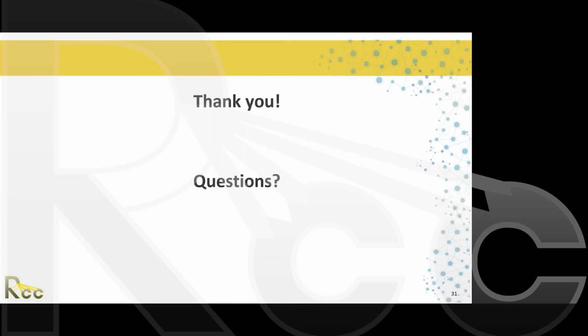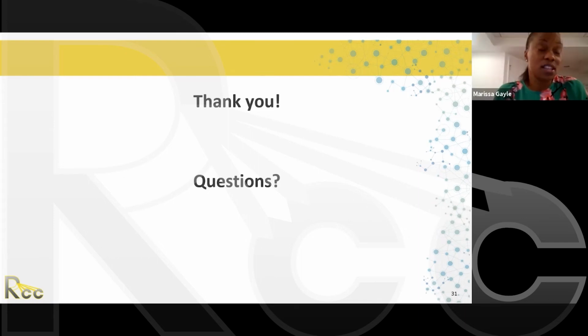Someone in the chat called it a ball bearing. That makes sense. It's a mark. It's a little circular mark that you're placing where you're marking your isocenter, so that when you do the CAT scan, physics, dosimetry and the planning team can see exactly where the isocenter is. So ball bearing doesn't sound too far off, but I can definitely find out that information when I go into the clinic on Monday.